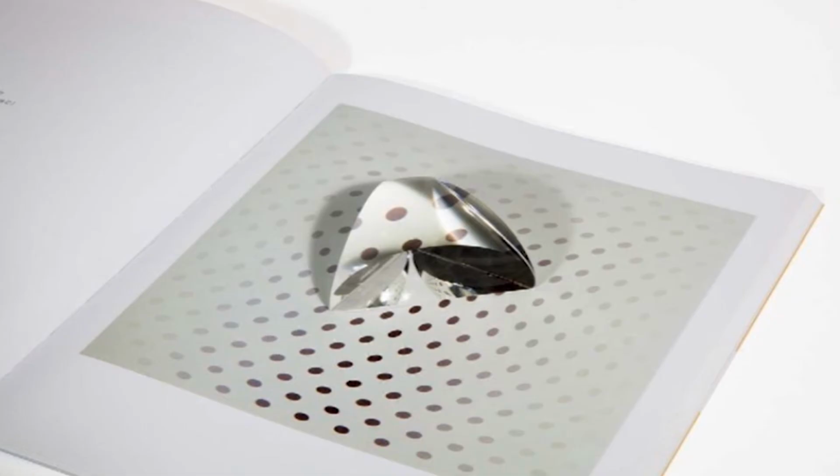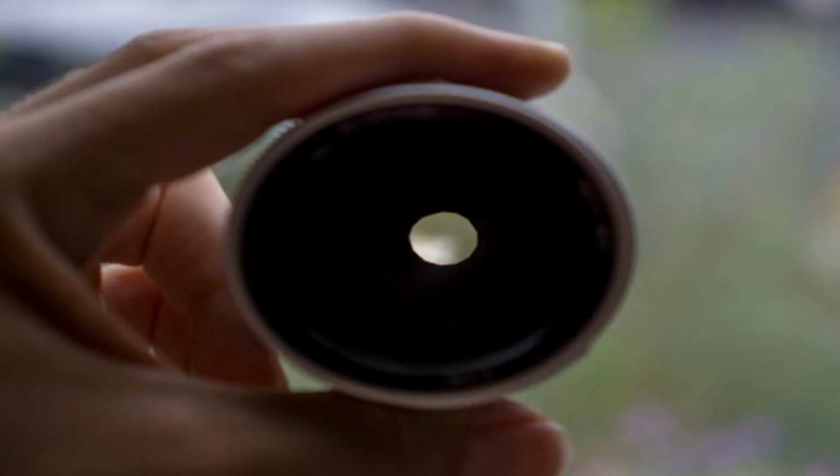Optical devices or aids use lenses or prisms to magnify, reduce, or otherwise change the shape or location of an image on the eye's retina. Optical devices may be held in the hand, rested on a base or stand, or be placed in a pair of eyeglasses. These devices are called optical devices, which involve the use of lenses to improve vision, whereas non-optical devices help bring images closer to the eyes. Let us discuss the types of low vision devices in detail.